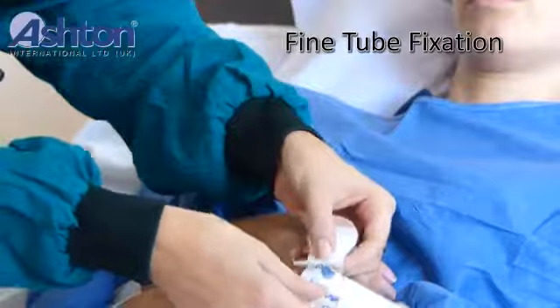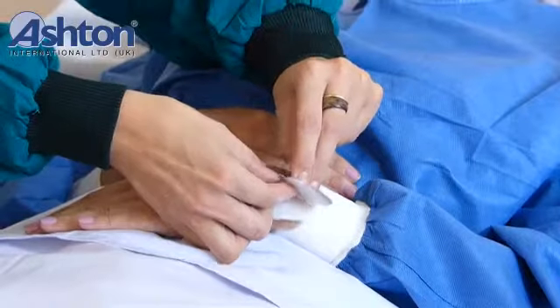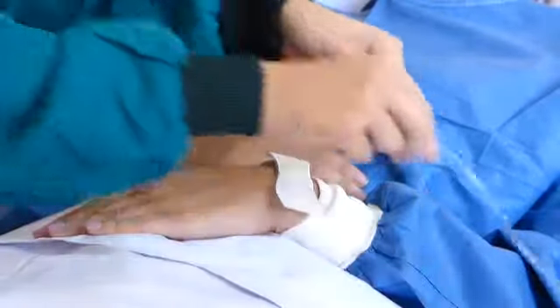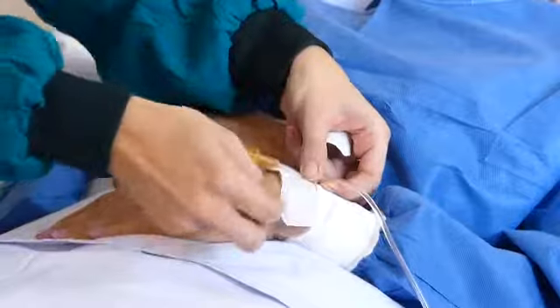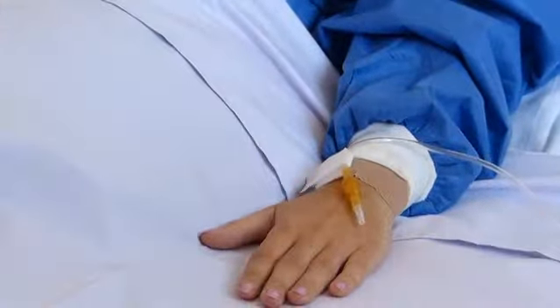IV tube fixation, or for other fine tube support. Hope this will help you and make the use of AshFix Tube Attachment Support easier. Thank you.